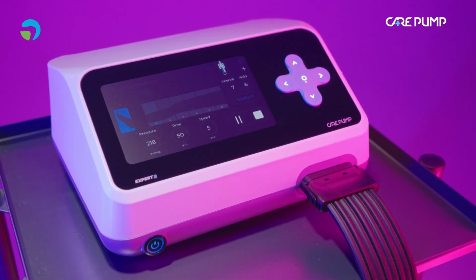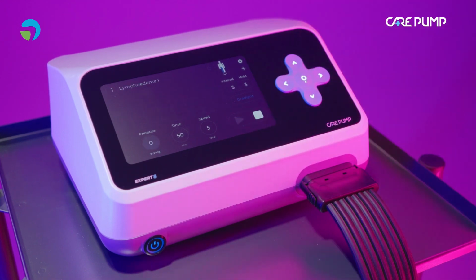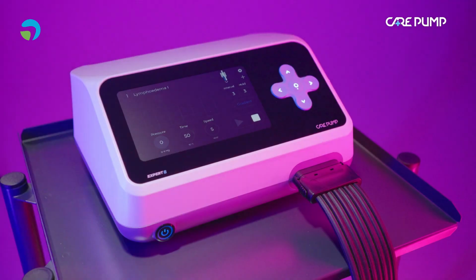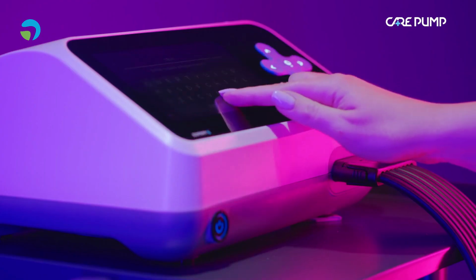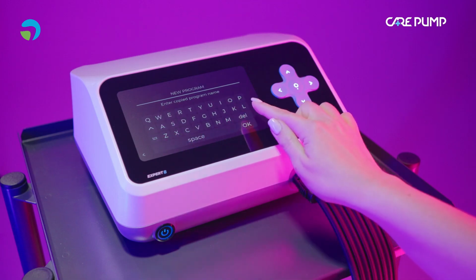To end the treatment before the specified time has elapsed, press stop icon. It will deflate air from the chambers in the cuff and reset the treatment settings. Copying a program to the list of user programs. To add the selected program to the list of user programs, use plus icon in the upper right corner of the screen. A keyboard will appear on the screen with which you can set a name for the copied program.